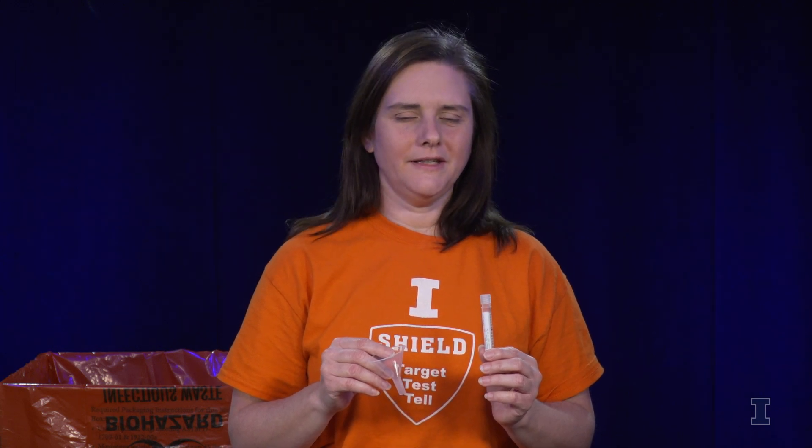I'm going to give you directions on how to take a COVID saliva test. You will receive a funnel and a test tube for your saliva test.